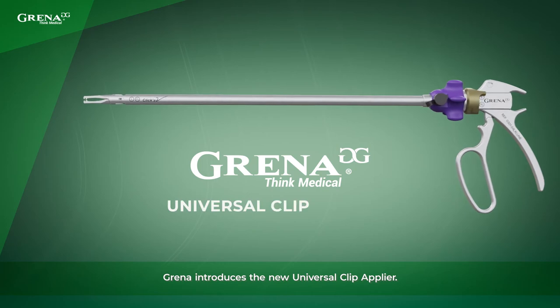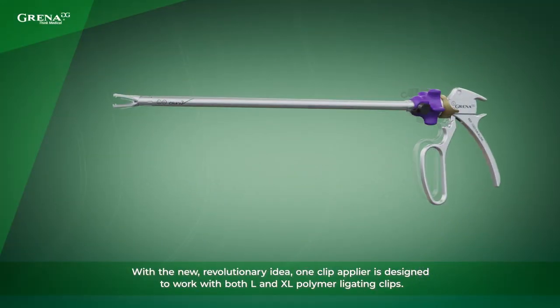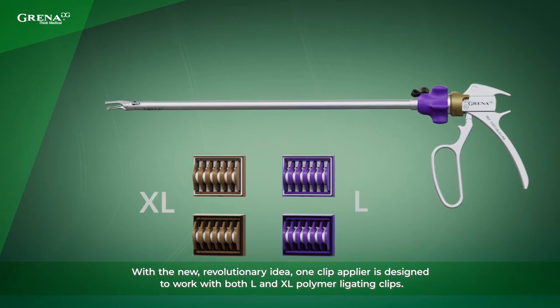Grenna introduces the new Universal Clip Applier. With the new revolutionary idea, one Clip Applier is designed to work with both large and extra large polymer ligating clips.